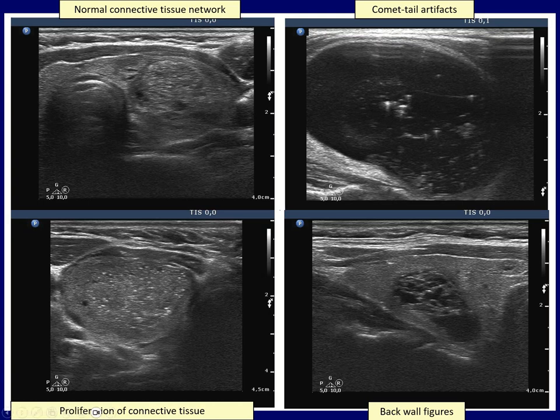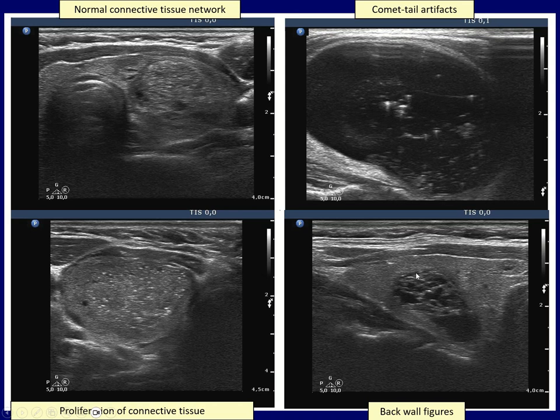There are numerous comet tail artifacts within the cystic part of this nodule. Some have a large dorsal tail, others have a small dorsal tail, while many lack it entirely. The last image shows again a cystic nodule. The echogenic lines and granules at the dorsal part of tiny cystic cavities are the back wall figures — visible here as lines, granules, and spots.